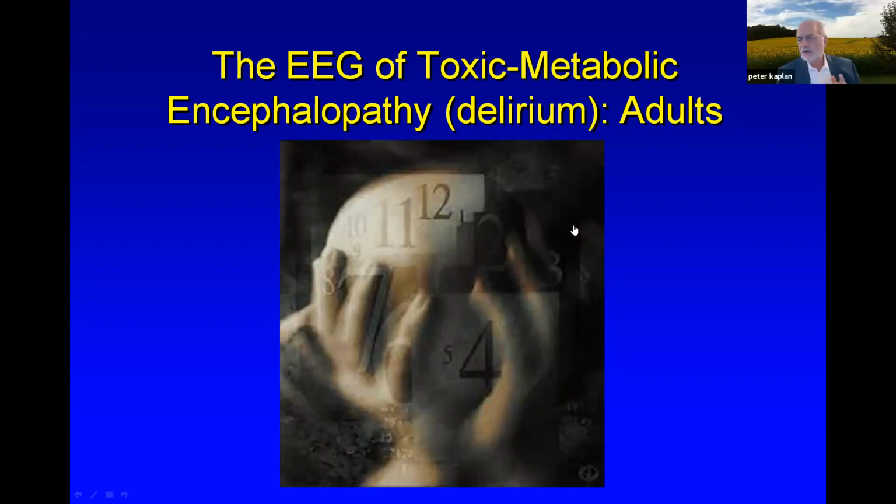Well, so two caveats. The international colloquium on status epilepticus that produced these criteria, the EEG criteria of non-convulsive status, was actually my workshop with others. And we came up with that because we thought that that encompassed the likelihood. It's not a real evidence-based thing. It's more of a gestalt that those ones that we saw, we believed you had to do a cutoff.